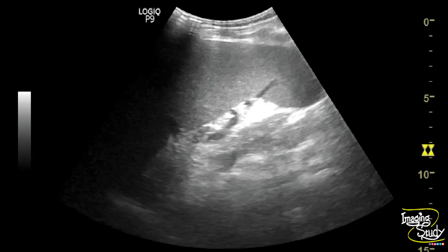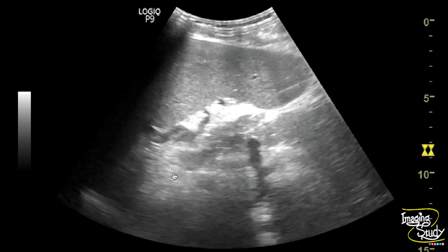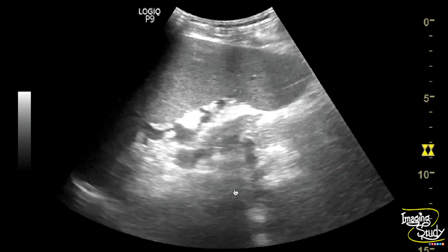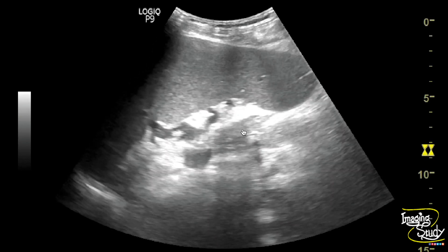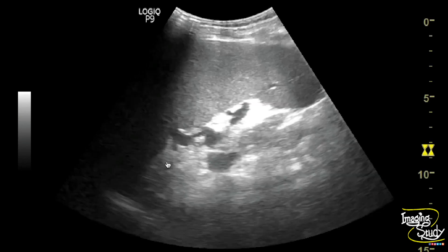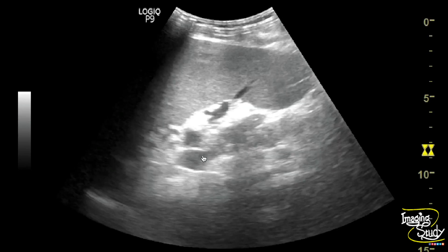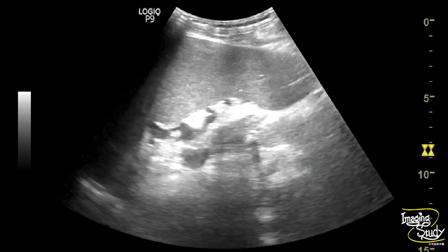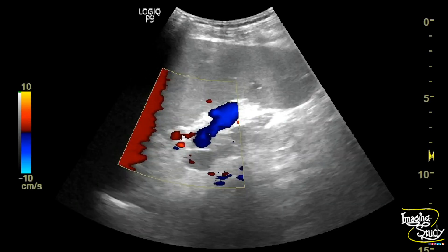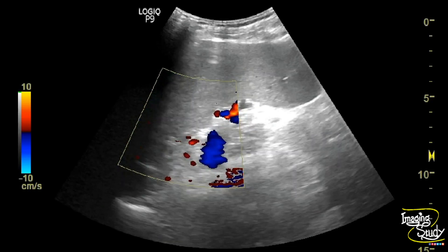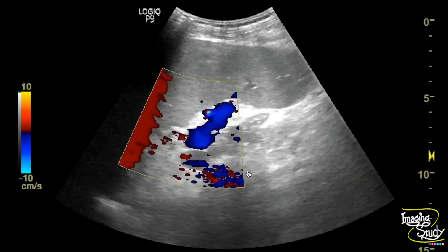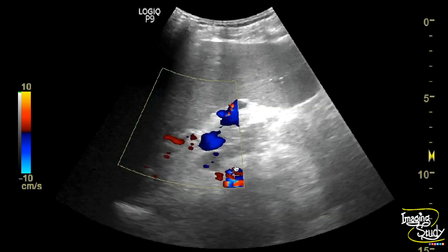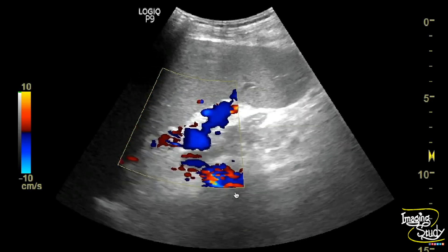Here you can see the spleen looks enlarged, and the splenic hilum shows multiple dilated vessels. When we apply color Doppler, you can see dilated tortuous vessels at the splenic hilum indicating splenorenal varices.